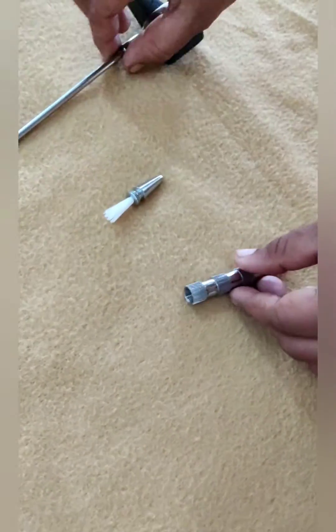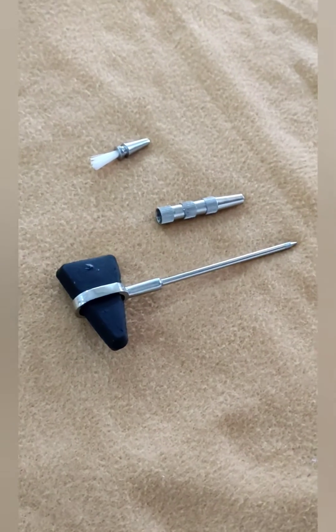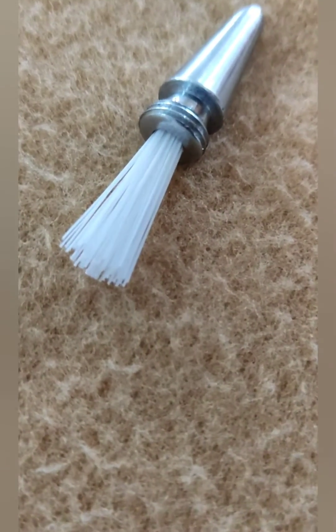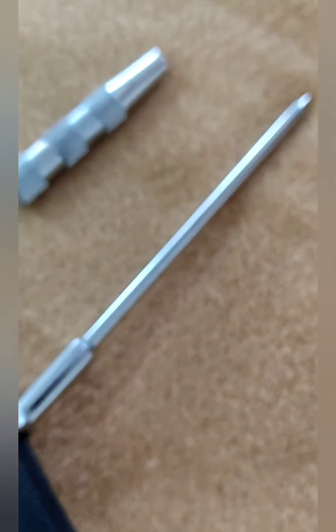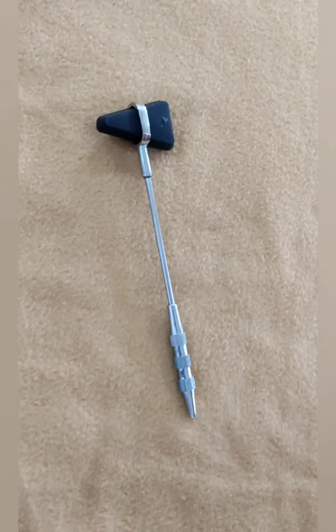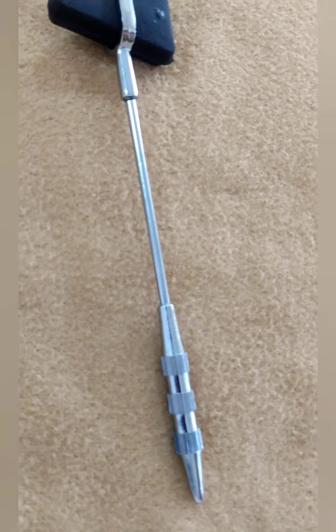The knee hammer is used to check reflexes — usually the set of deep tendon reflexes that are tested involving the higher regions of the spinal cord. Examples include the ankle, knee, abdomen, forearm, biceps, and triceps. Sometimes it is also used to check chest percussions and abdominal percussions.